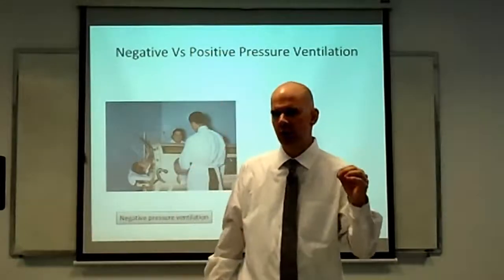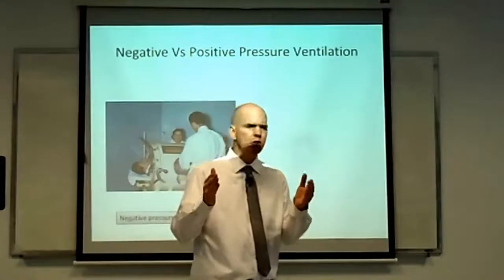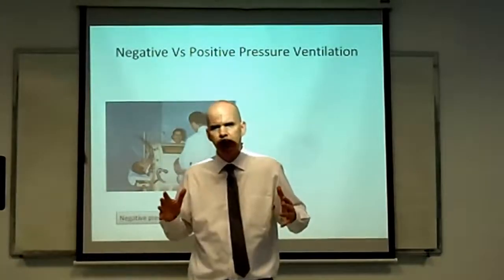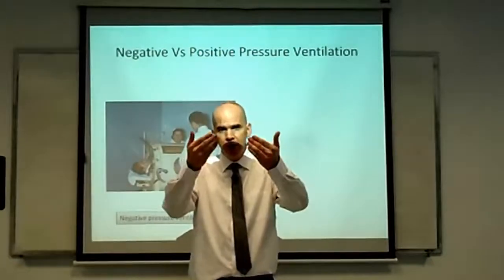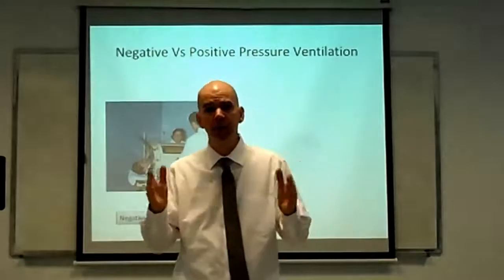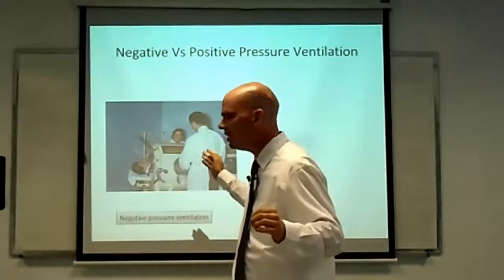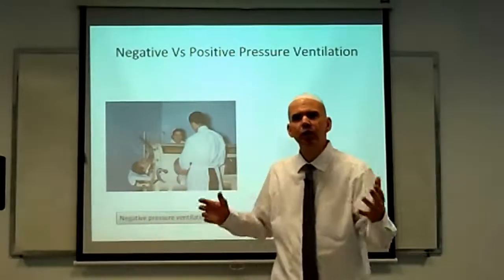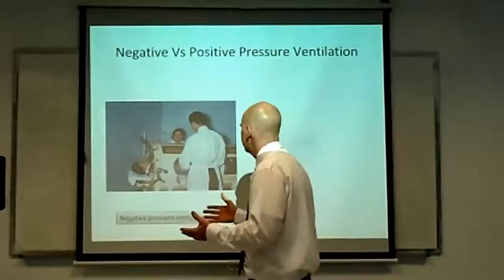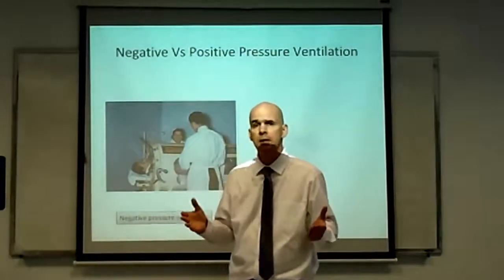These machines worked great insofar as they mimicked normal physiology. After all, when you breathe, what do you do? Your diaphragm goes down. This opens up your lungs, causes a negative pressure that causes air to be drawn in. You essentially are a negative pressure ventilator. The problem with these negative pressure ventilator machines, though, was that they were too big, too impractical, too unwieldy. Look at them. They covered up the patient's entire body, so you couldn't even do a proper physical exam.